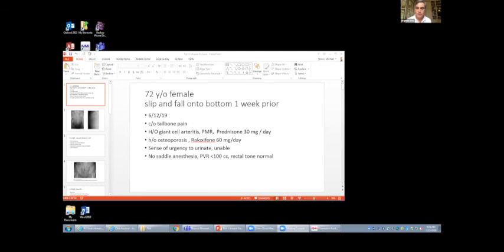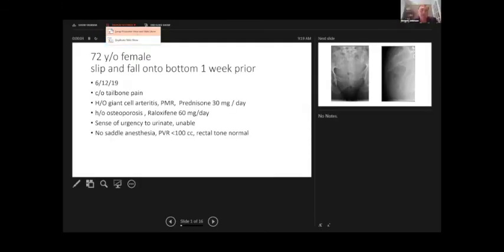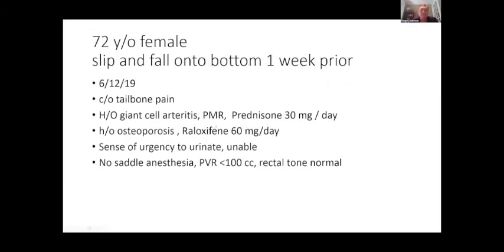I'll just ask you one question while we're going to the next thing. Is there any role for definitive treatment of a symphysis dislocation with an external fixator in your practice? Very limited. The stability you get from an external fixator is quite poor. So in almost all cases, I think the symphyseal plating is preferred. There may be some particular situations where patients had a bladder rupture and extreme infection, and you really don't want to be putting fixation in. But in most cases, even with urologic injury, with a repaired bladder and a cleaned out symphyseal region, I prefer to put in a plate.